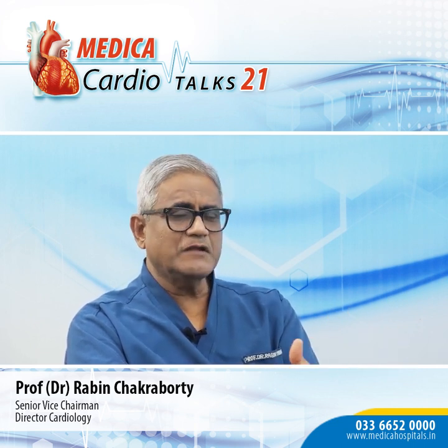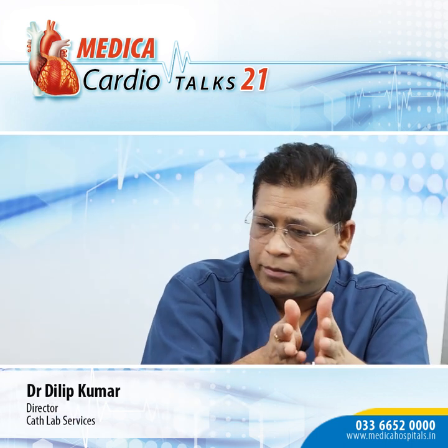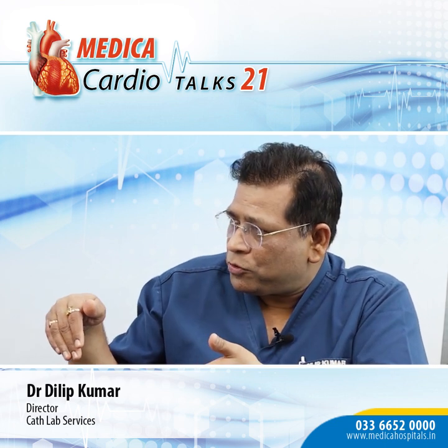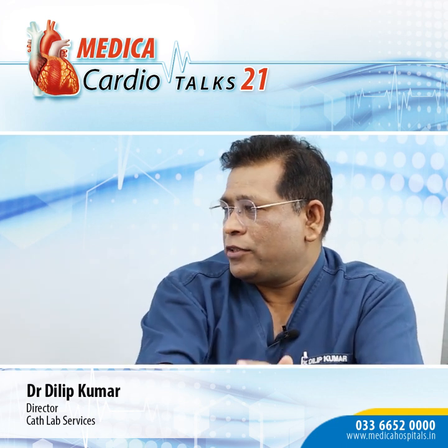Unlike the mitral clip, many tricuspid regurgitation cases may require more than one clip. With tricuspid valve repair, they would require at least two clips, maybe more. We have to start adjacent to the anteroseptal commissure, because there the gap is less. So you start there and put a clip, then from medially, also in the central part, you reduce the gap, and then further clips can be done again. So that's how it's done.